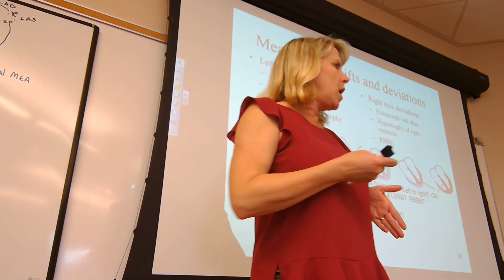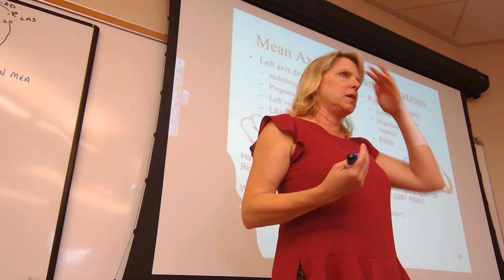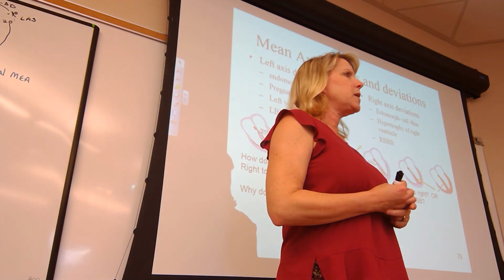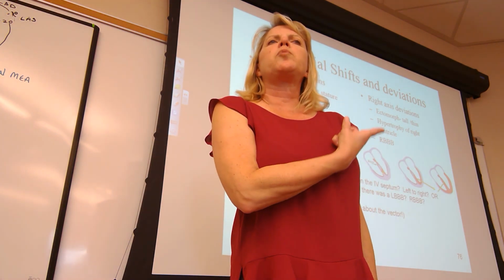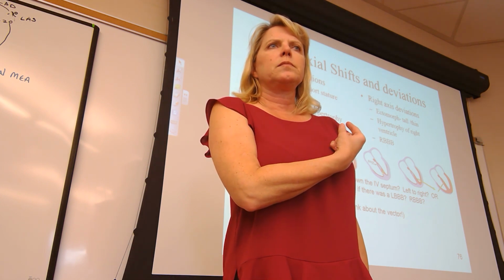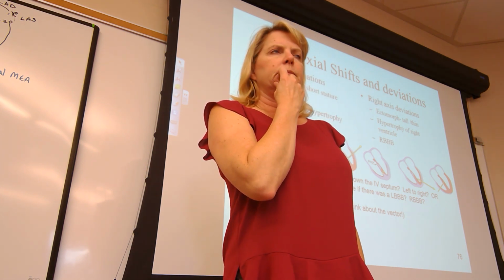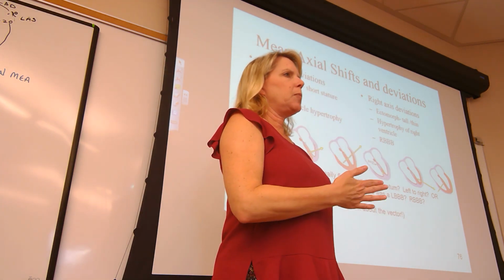Left bundle branch block, left ventricular side, waiting even longer for that action potential. Then the MEA is going to point that way. Vectors point to positive surface charge. Good? Okay.